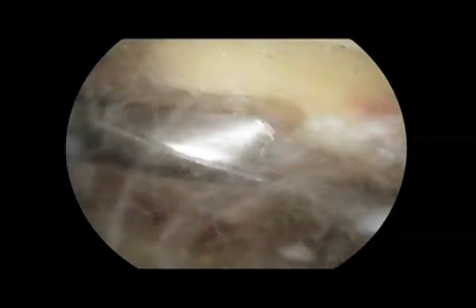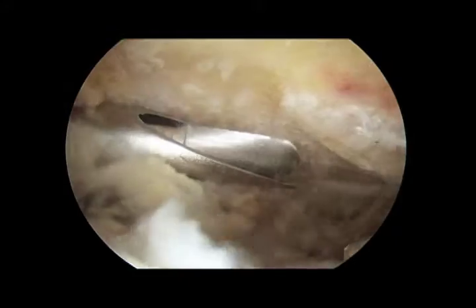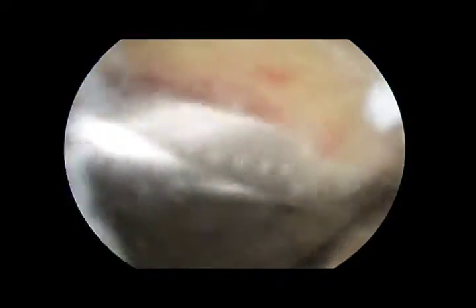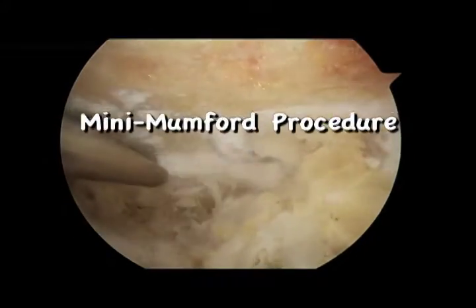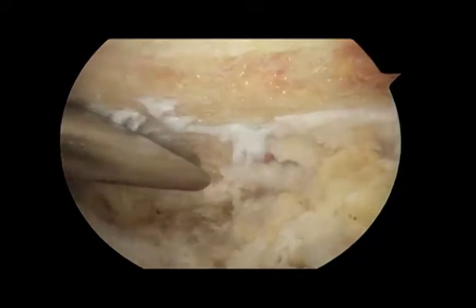Beginning at the level of the posterior AC joint, we complete the resection, progressing medial to lateral and posterior to anterior, always resecting to the level of the lateral trough. This trough not only resects the prominent edge of the laterally sloped acromion, but it also serves as a frame of reference, preventing over-resection. The inferior osteophyte at the distal clavicle was then resected flush with a subacromial resection, preserving much of the AC joint itself.